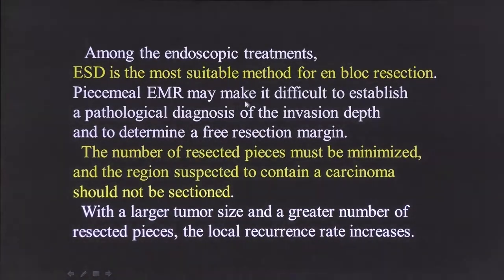And piecemeal EMR may make it difficult to establish a pathological diagnosis of the invasion depth and to determine a free resection margin. And as I explained before, the number of resected pieces must be minimized, and the region suspected to contain a carcinoma should not be sectioned.